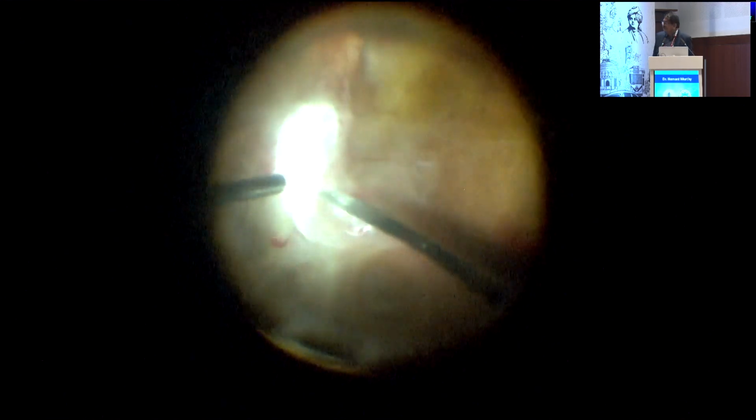Once you have done this dissection, then you can use any of the instruments. I think I'm finished; these are all just to show you the concept. Then you can use the scissors to cut off the fibrovascular tissue. Because there are so many presentations on diabetic vitrectomy, I just wanted to show some small steps that you could adopt when you do diabetic vitrectomy.